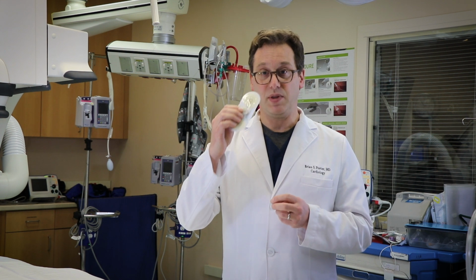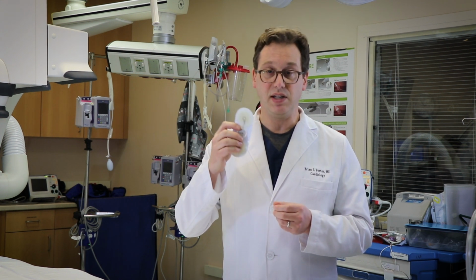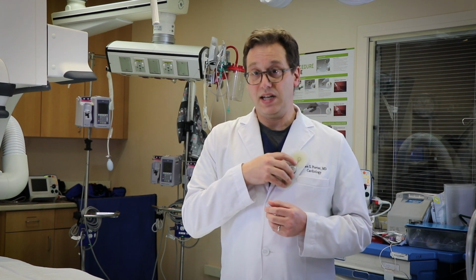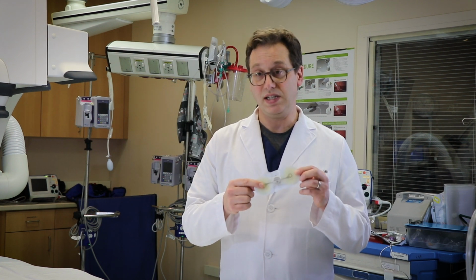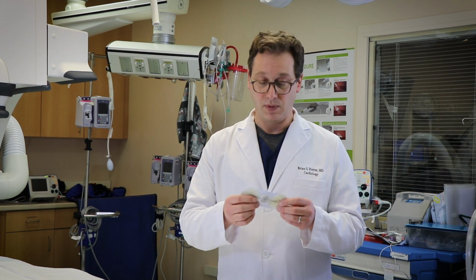Inside of this is a chip that's very inert and can't be damaged by any activities that you do or showering. And you wear that monitor for up to 14 days, and it can save information about every single heartbeat that you have during those 14 days. So for someone who is having infrequent symptoms, such as a feeling that their heart is racing or a feeling that their beats are skipping or somewhat out of sequence, that patch monitor can be a very useful bit of information for you and your cardiologist.